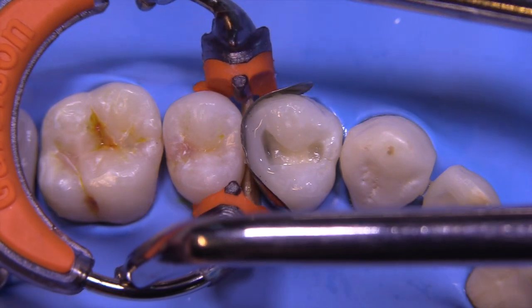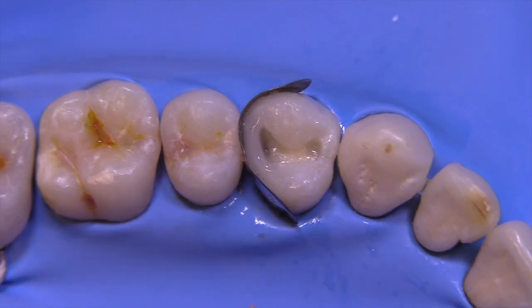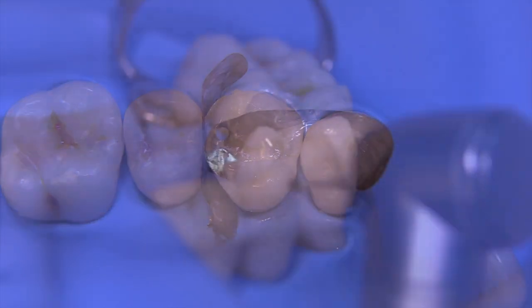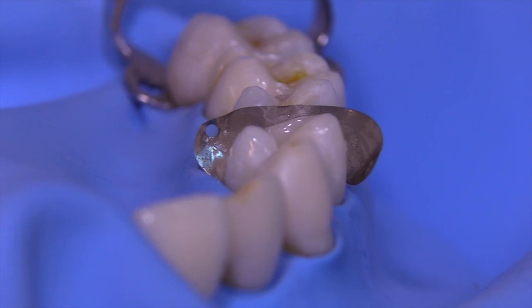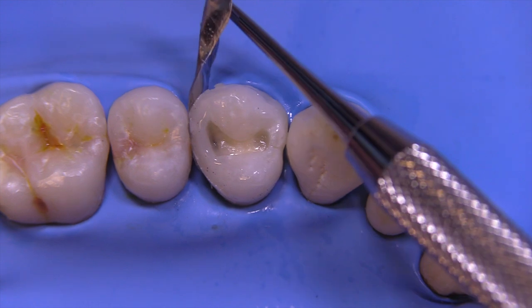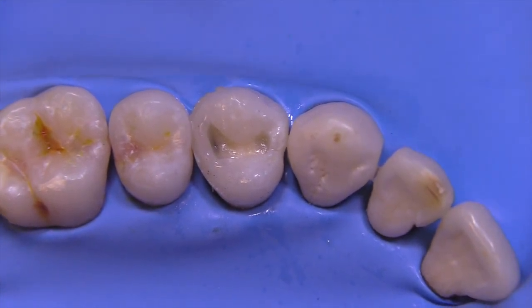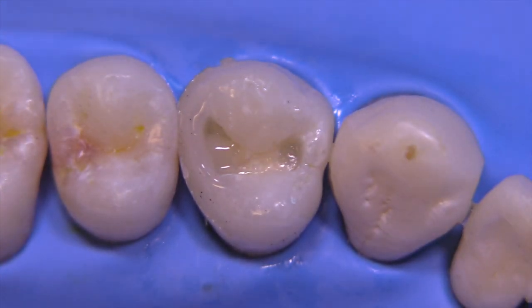We've just taken our class two and converted it into a class one — a much easier procedure with greater access. I drilled a hole through the band so that I can easily pull it out. Some companies have holes in the bands already. We use an instrument to just easily pull the band out.